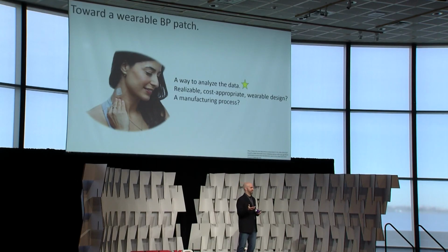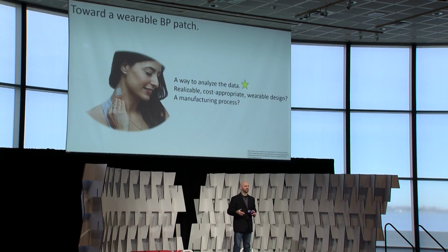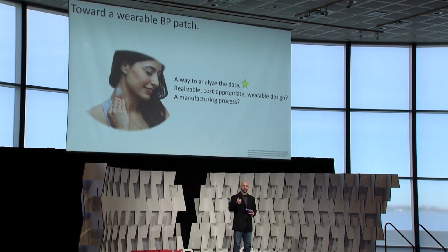But ultimately, the direction that we're going is how do we now use this to enable a blood pressure patch? And I'm going to leave this as the teaser, because this is something we're working on now. To do this blood pressure patch, I argue you need 3 things. You need an approach, an algorithm, a way to make this measurement. And that's what we've demonstrated with this handheld device, a way to acquire data that's ultrasound and force, and to process that data and give a very strong estimate of the internal pressure, our blood pressure. But then you also need a way to make this a thing that you wear, and then you also need a manufacturing process. So I'll leave that as a teaser for maybe next year.